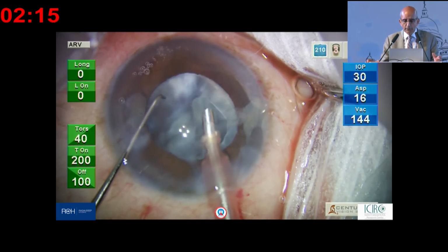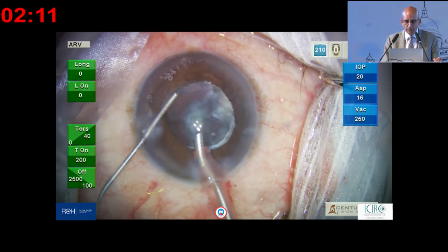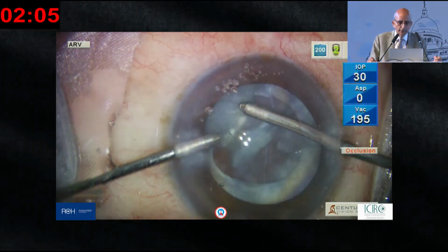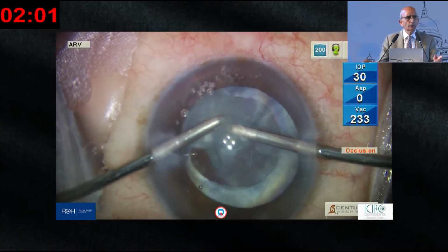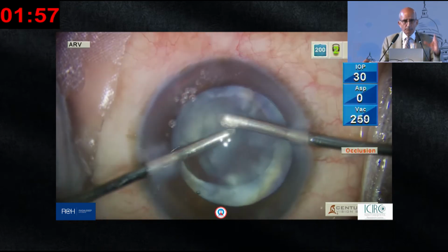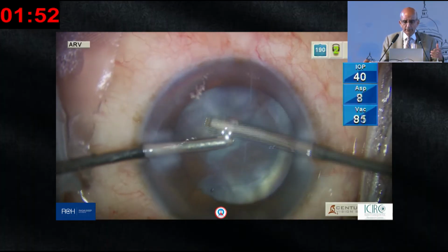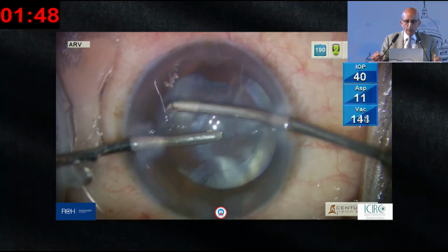That's because the chamber is very stable and the right flow rate. Once again, injecting visco. Notice the pupil has gone down. So we injected intracameral adrenaline, and that's why you see now the pupil dilated. Remember, you can use adrenaline in between if the pupil constricts, because of the mechanical stimulation of the lens material coming near to the pupil.